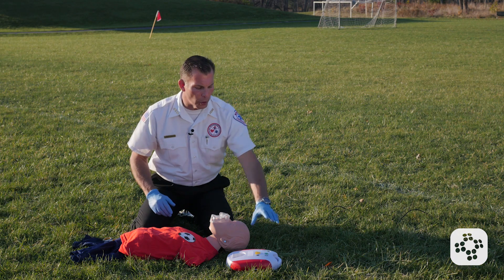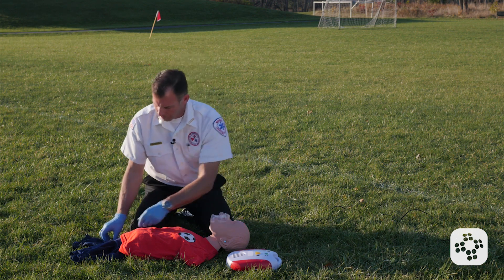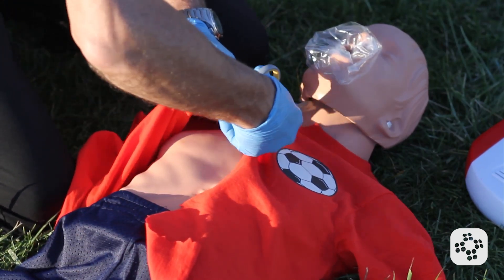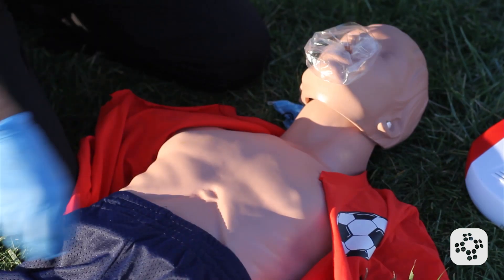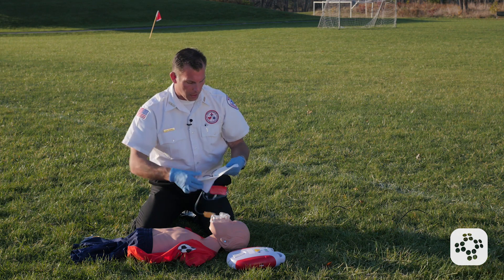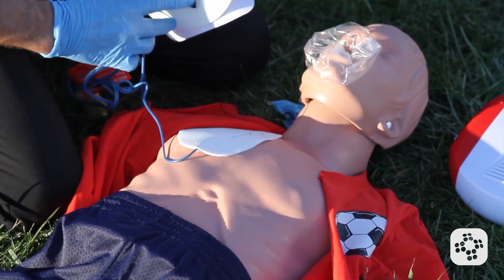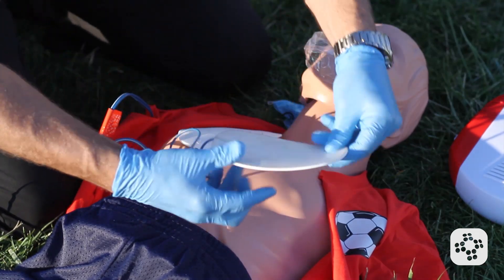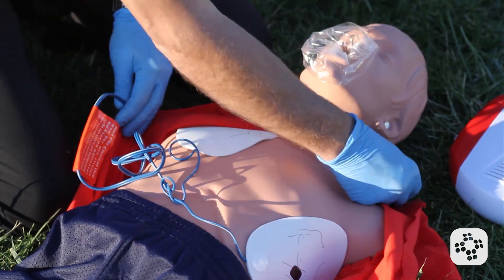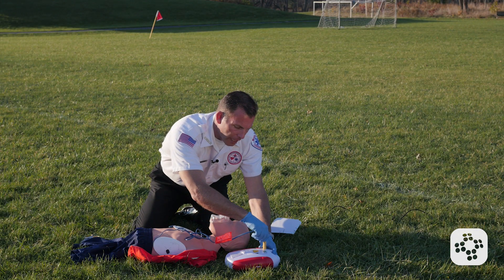So the first thing we're going to do is place the AED by our patient and turn it on. Remove clothing from the person's chest — if I have scissors, I like to cut it because we don't know if there's a spinal cord injury. I grab the pads and open them up. This child is about 65 pounds, so I'm going to place them like I would an adult. Make sure they're firmly on the chest, and if there's any jewelry, move it out of the way.